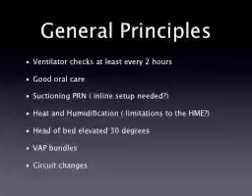Another thing I'd like to add is the cuff pressure check. We should be doing that at least a couple times a shift as well. We want to keep our cuff pressures ideally in the 20s, certainly no higher than 30 or 35, simply because we can cause tracheal ischemia and possible necrosis if our cuff pressure is too high.